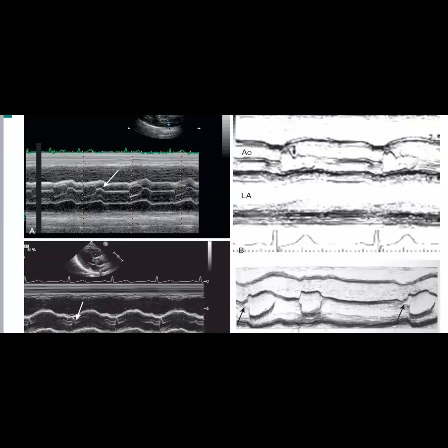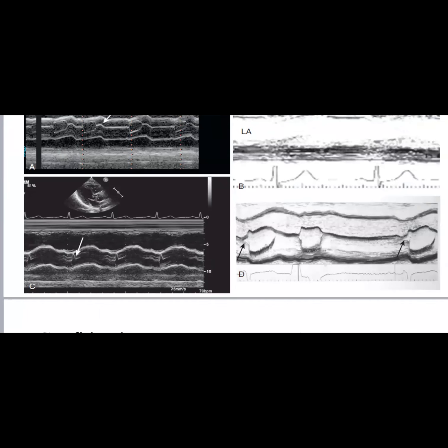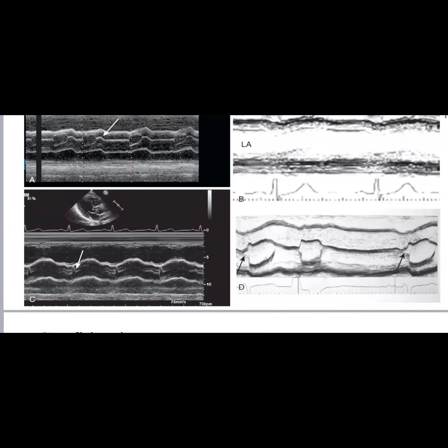The one on the C. Where is C? Any guess? Aortic regurg? Not really.